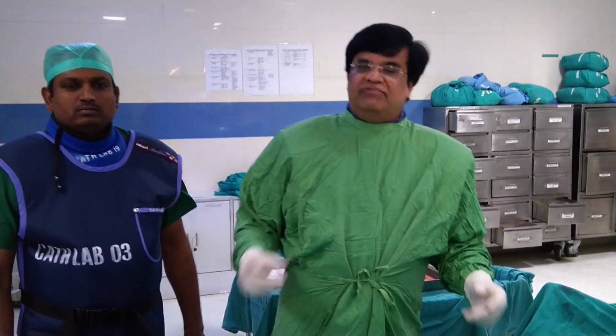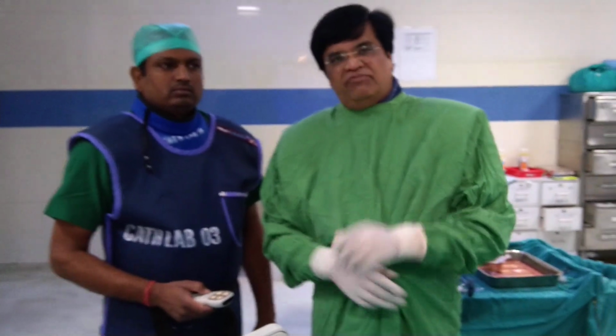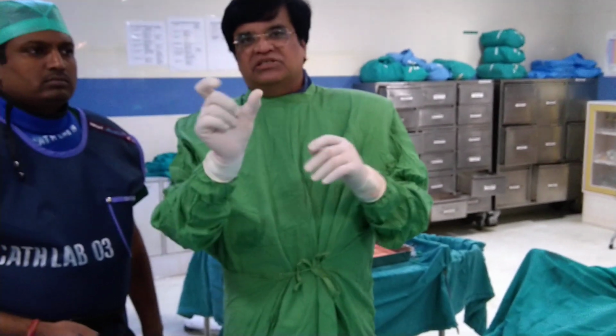The second point is that whenever you plan, you should always have in mind the size of the stent. I was thinking the 38mm would be short, and he also agreed. So we always use the distal part of the guide wire, which is a 30mm segment, to get an idea whether 38mm is enough or not. Actually it was not, and that's why we used a 43mm long stent. This was a perfectly good example.